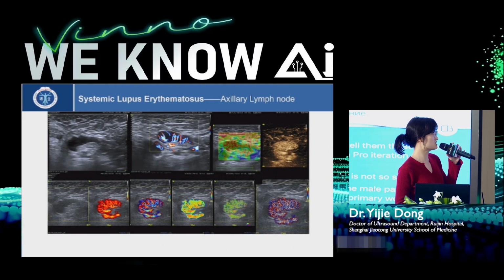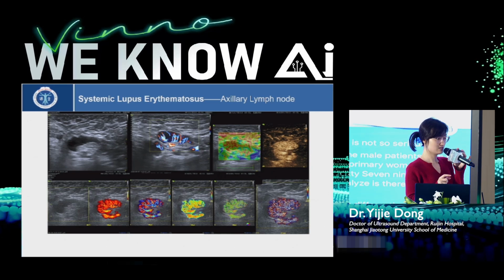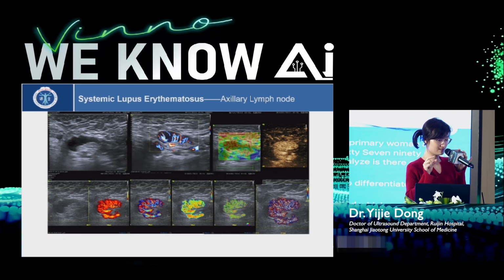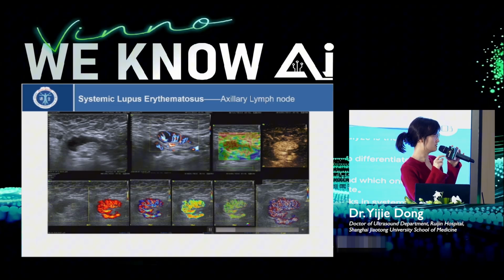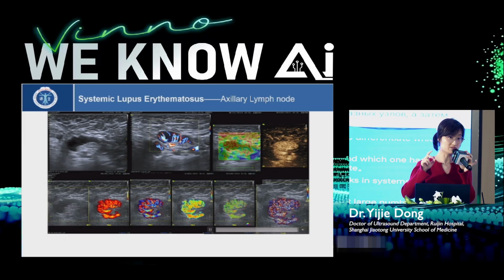We can also use SRUS in systemic lupus. This is a slightly large lymph node in the axilla, with a thicker cortex and higher blood supply. With SRUS technology, we can show the very detailed vascular distribution within the lymph nodes, and then use this we can also do biopsies.